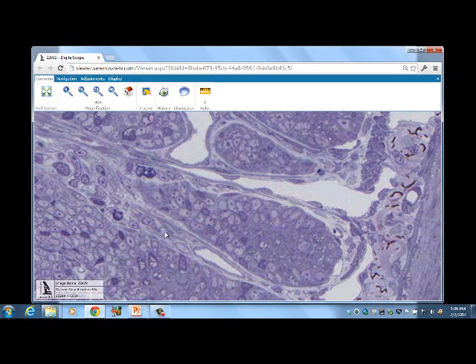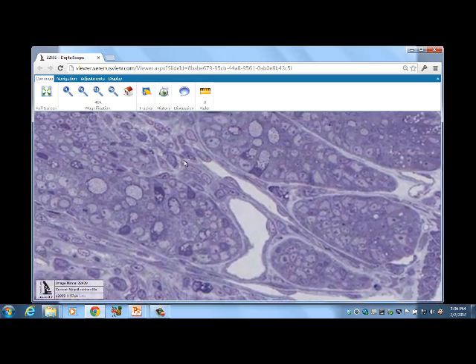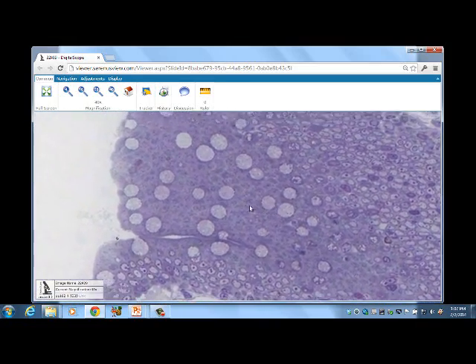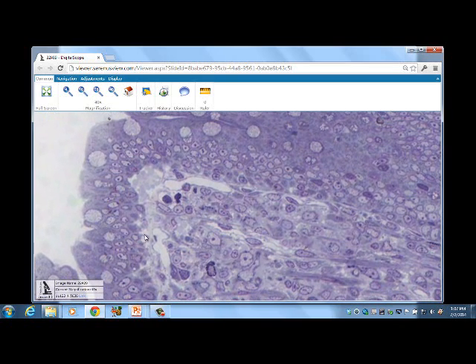This is epithelium here. This is connective tissue, and we see some mast cells. They have uniform granules about the same size, dark, are the mast cells that we see there. But these are nice endothelial cells that you're able to see. These are sections through the intestinal absorptive cells and the goblet cells. This would be the goblet secretions.